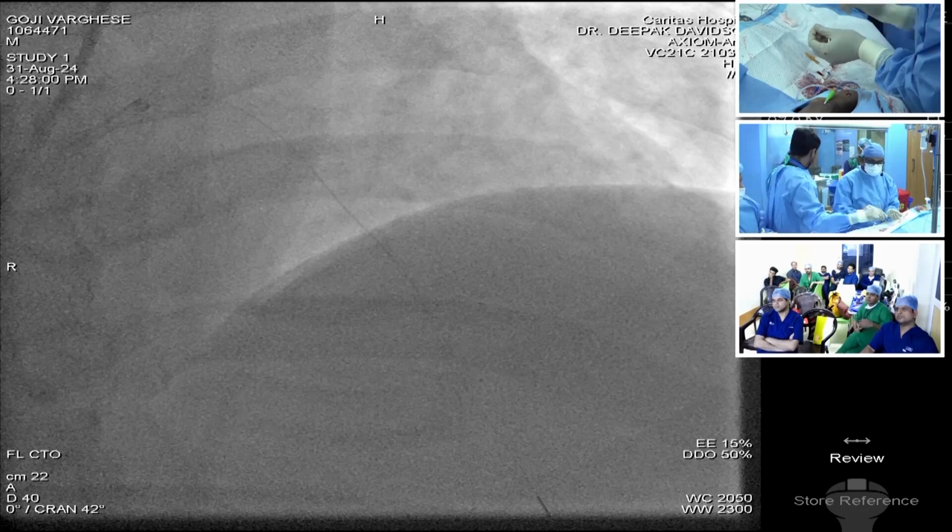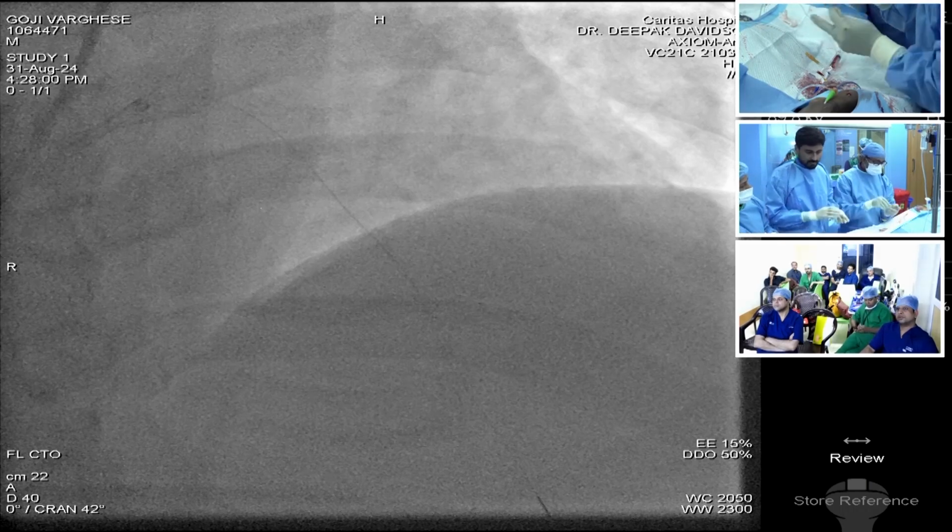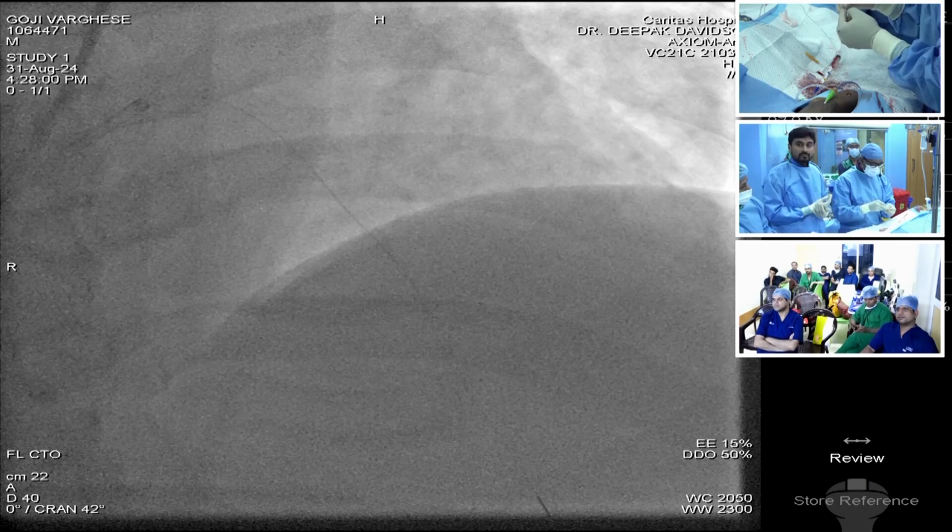We will have 20 cc syringes here. Joel, show the live image.